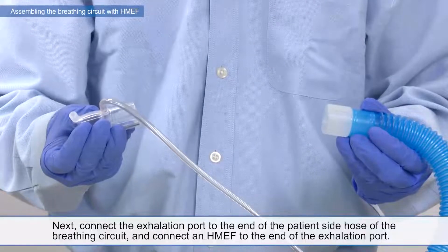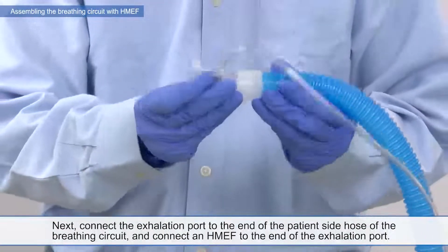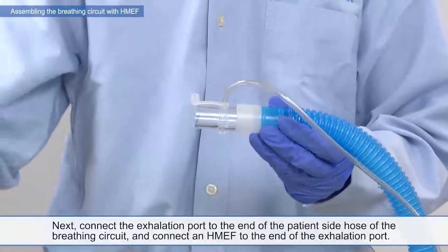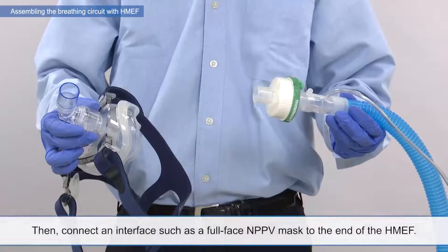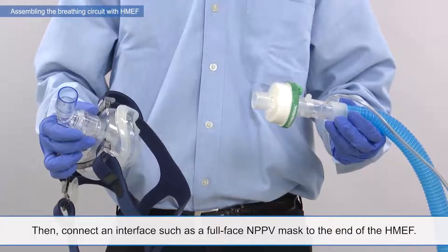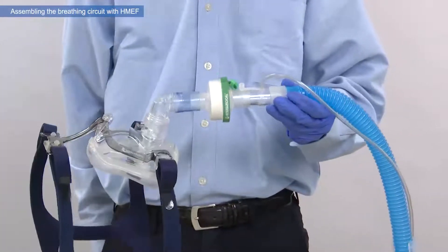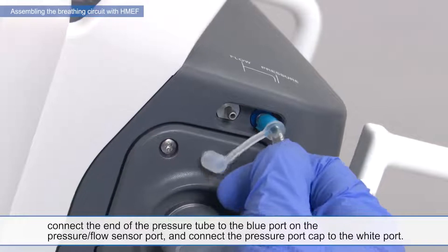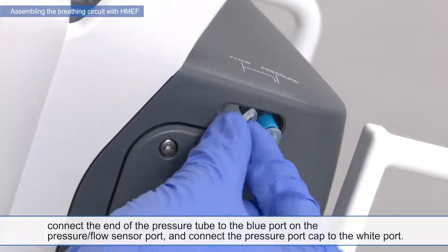Next, connect the exhalation port to the end of the patient side hose of the breathing circuit. And connect an HMEF to the end of the exhalation port. Then, connect an interface such as a full-face MPPV mask to the end of the HMEF. On the right side panel of the ventilator, connect the end of the pressure tube to the blue port on the pressure flow sensor port. And connect the pressure port cap to the white port.